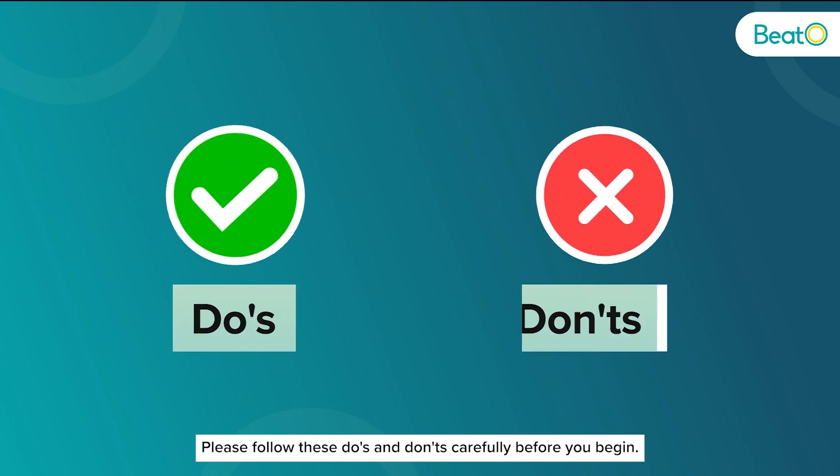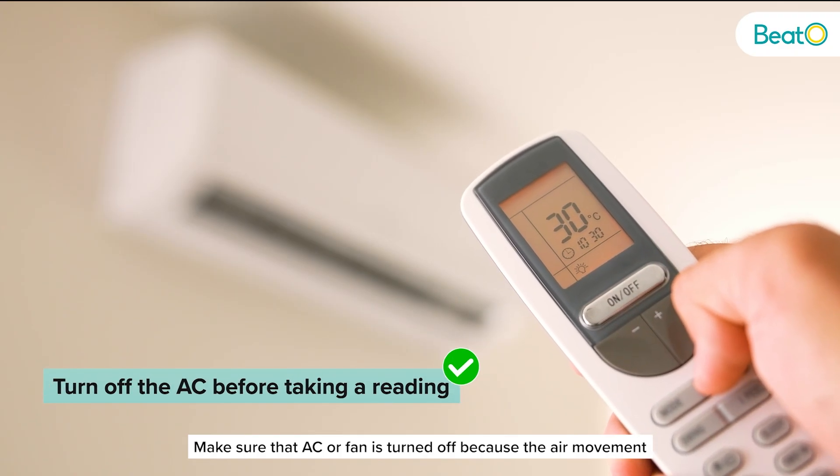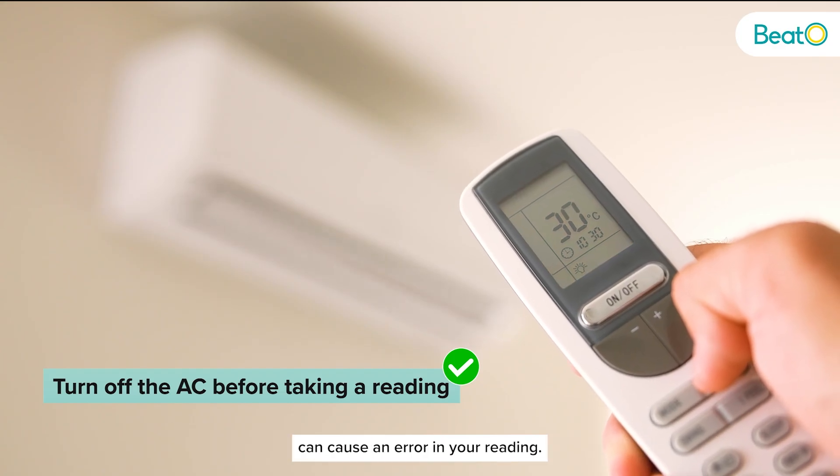Please follow these do's and don'ts carefully before you begin. Make sure the AC or fan is turned off because the air movement can cause an error in your reading.